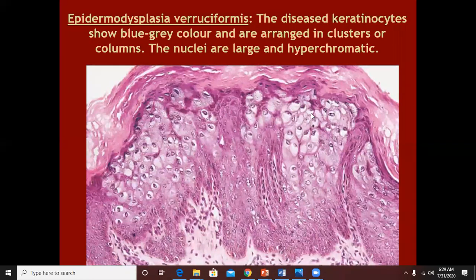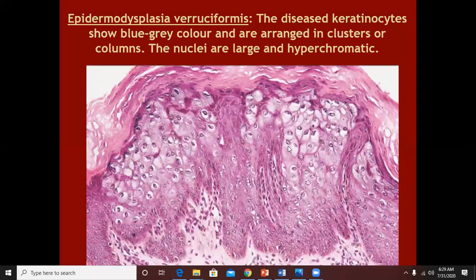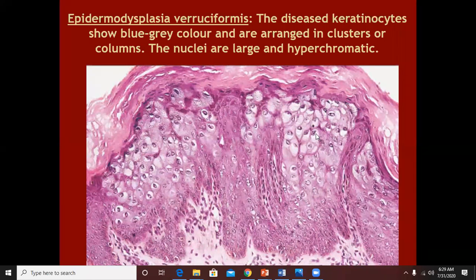Sometimes the vacuolation will be more pronounced. The cells here are blue-grey and arranged in clusters and columns. These vacuolated keratinocytes are occupying most of the stratum spinosum as well.